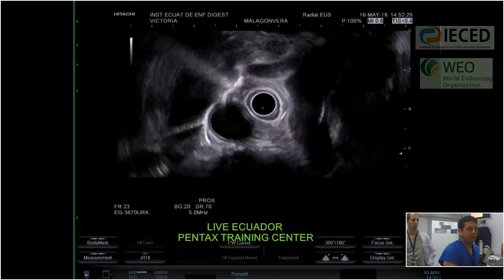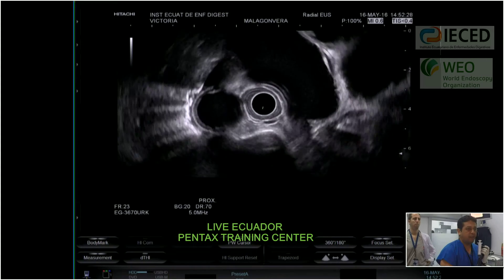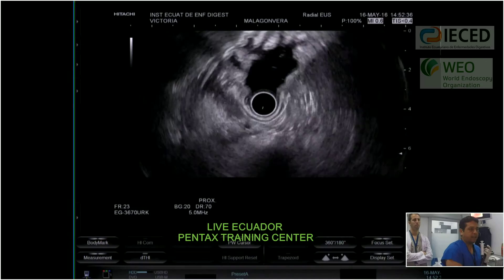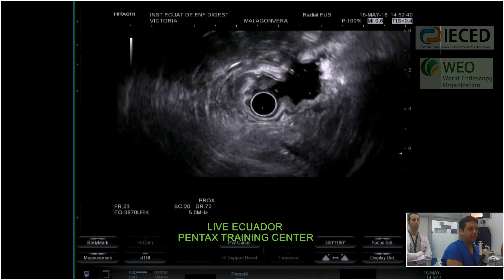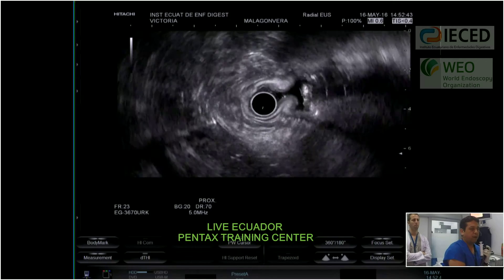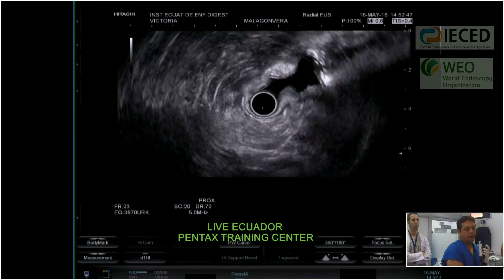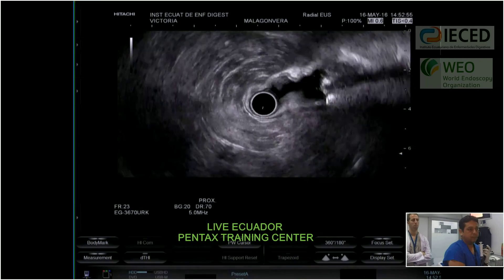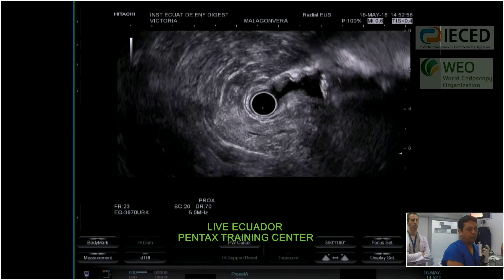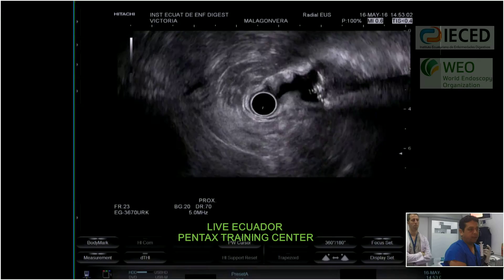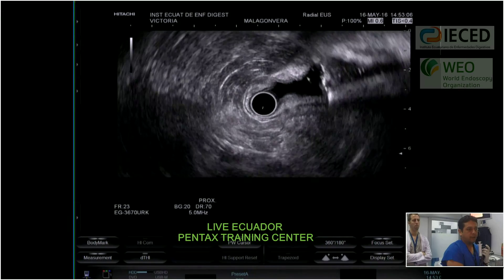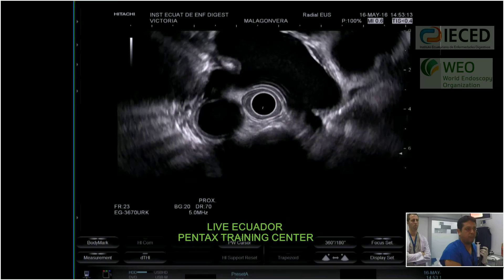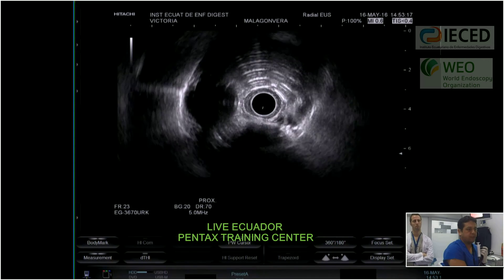In this endoscopic ultrasound, we do not identify any other kind of significant alteration. This patient probably has chronic pancreatitis, and we need to start treatment to see if there is any relief of symptoms. With all this data, we can confirm the diagnosis of chronic pancreatitis. This concludes the examination.